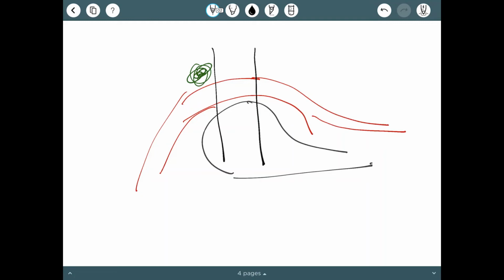So what can ultrasound do? Ultrasound can help us to see where the bifurcation is happening, whether it's happening at the inferior border. If it is happening very low below the neck of the femur, you are safe. I mean, no way you are going to hit the bifurcation area. But if it is happening higher, then some problem could arise, especially in procedures that require larger sheaths. By ultrasound, you can know what is the level of bifurcation. By ultrasound, you can see exactly how your needle is going into the vessel and you are having an access.